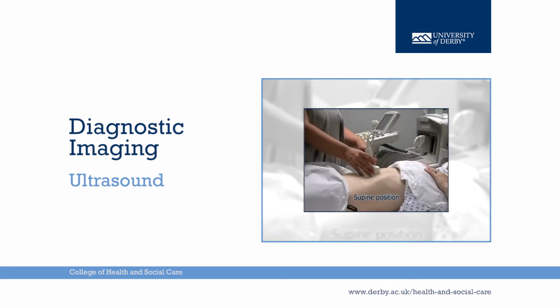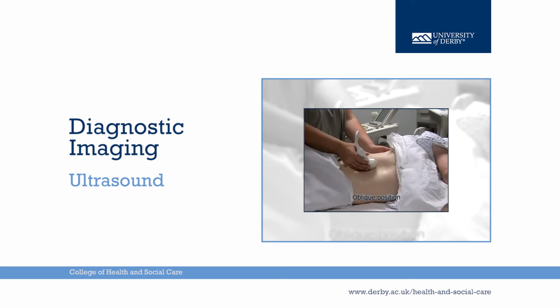Supine position. Oblique position. The patient is rotated to either side with the side being scanned raised. Deep inspiration and expiration are used to optimize the image. This position helps to move the bowel away from the area being scanned.